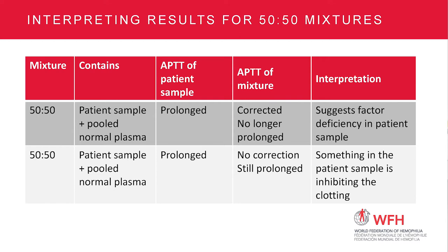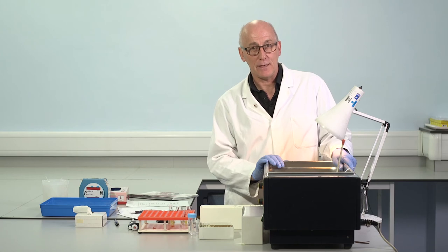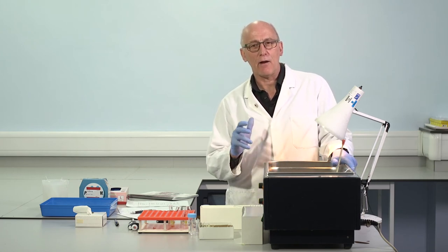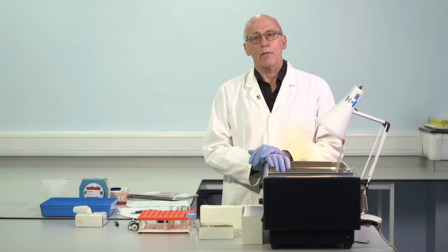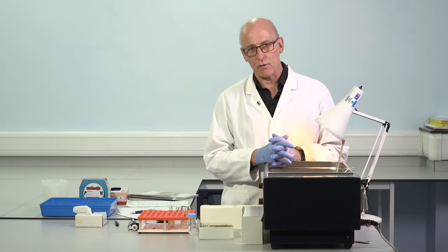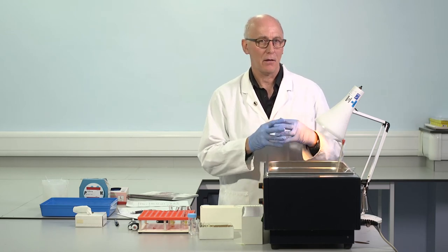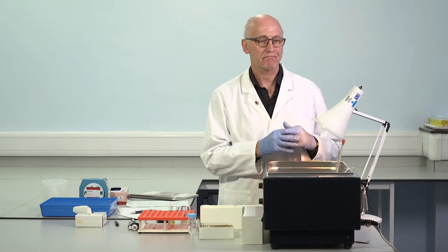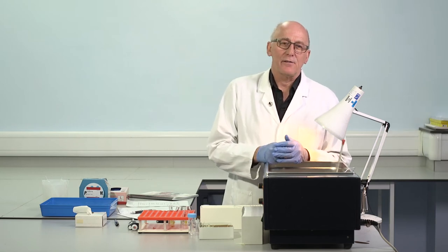I mentioned that if the time is restored to normal or close to normal, most likely it is a factor deficiency. But we have to keep in mind also that there are different types of inhibitor. Some inhibitors are able to exert their effect immediately, immediate acting inhibitors. The most common of these would be non-specific, not specifically directed against an individual clotting factor, but an antibody which blocks the reactions where they occur on the phospholipid present in the reagent. Lupus anticoagulant is the most common of these.